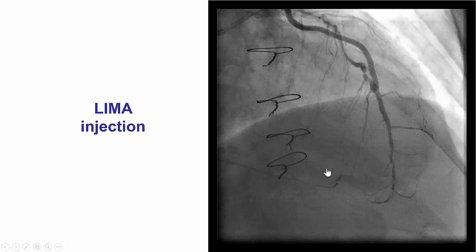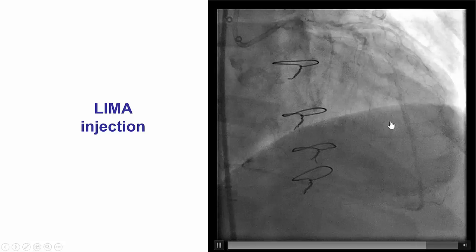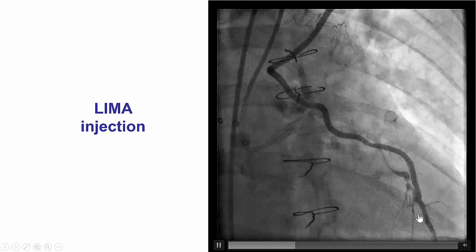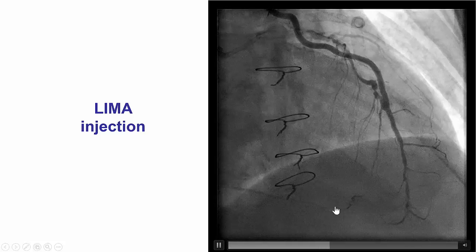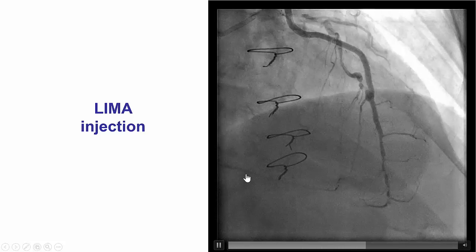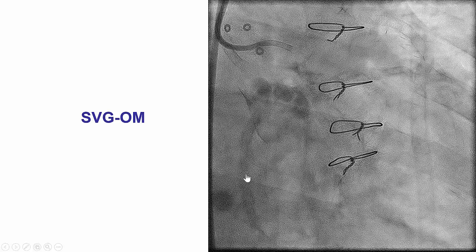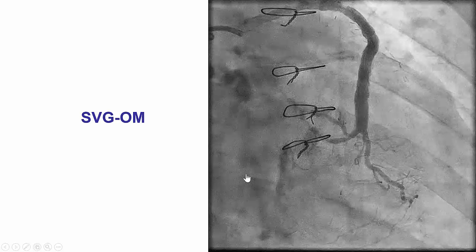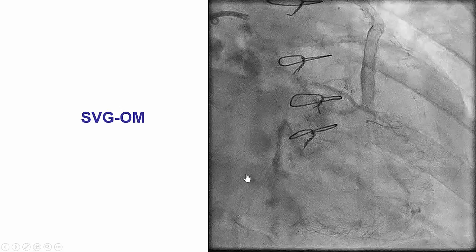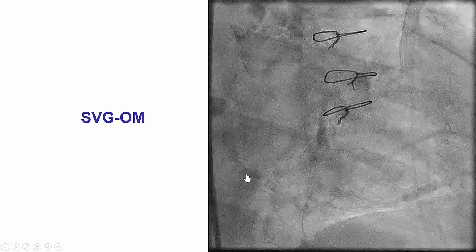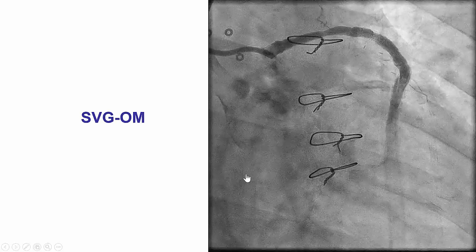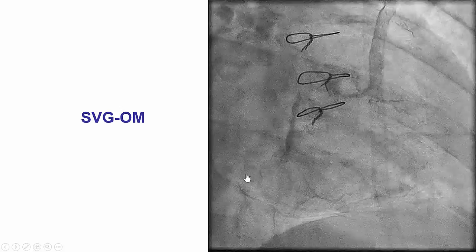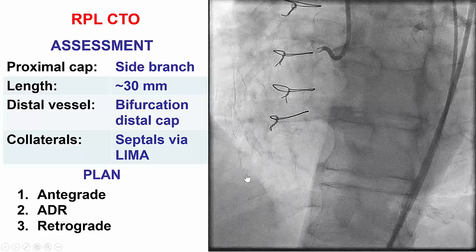The left anterior descending artery was filling from the LIMA, which in turn was providing collaterals to this large occluded branch. There was also a patent saphenous vein graft to the obtuse marginal branch that might provide some collaterals, although these are purely epicardial and very tortuous and hard to track.